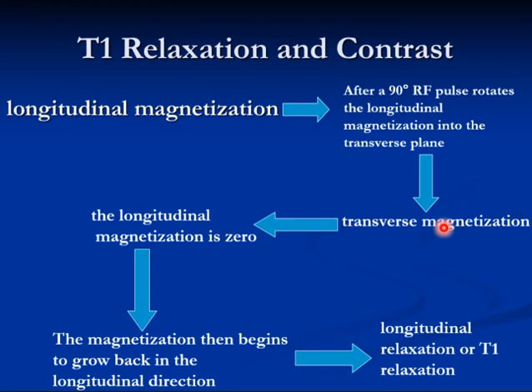The same thing. This is the longitudinal relaxation. The protons, instead of being transverse, will go into the longitudinal direction. This is T1, what we call time one, T1.